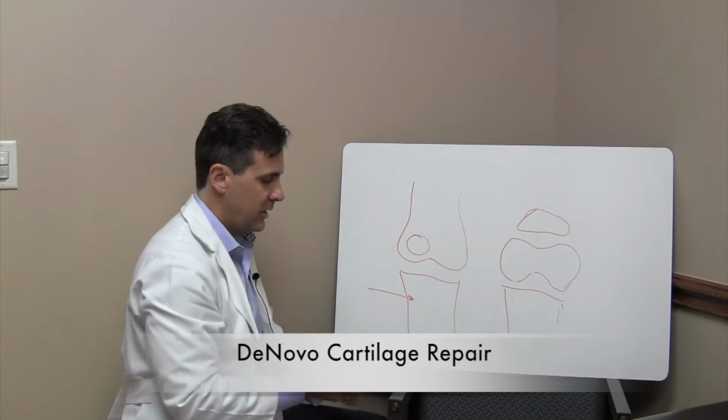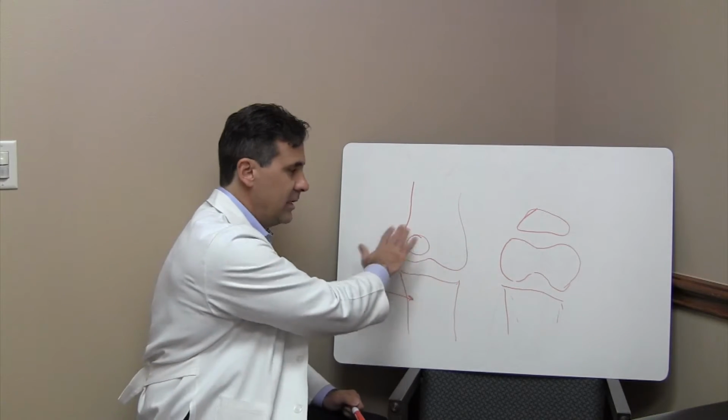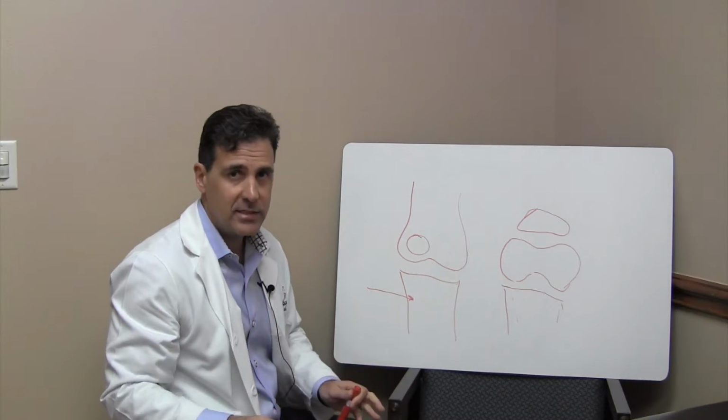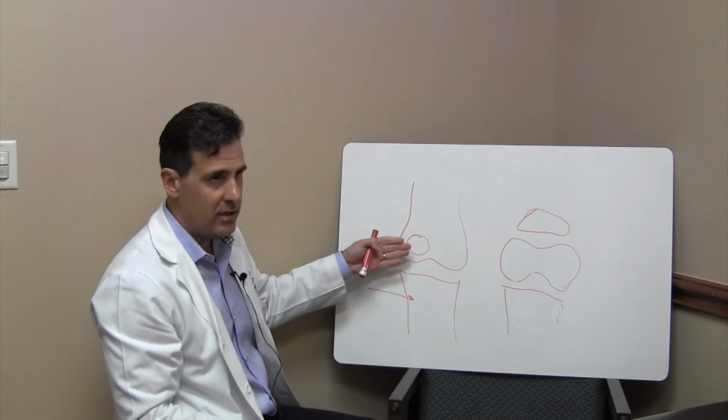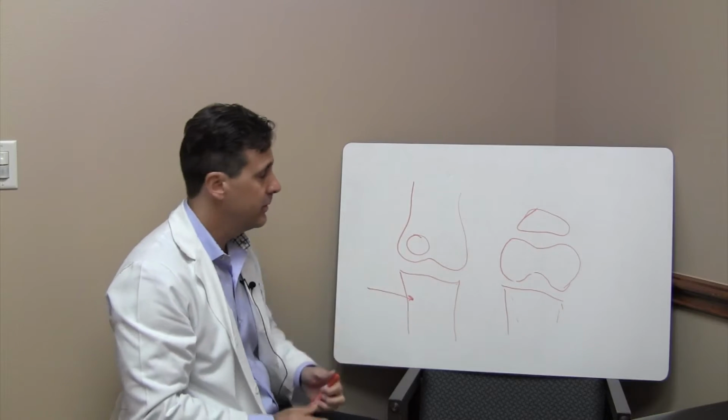Another option is something called DeNovo, which is the same thing. You have a large lesion here. You go in there arthroscopically. Once again, you clean the lesion, and again, it has to be an isolated lesion on one side of the condyle or the opposite condyle, but not on both sides and not throughout the whole joint.